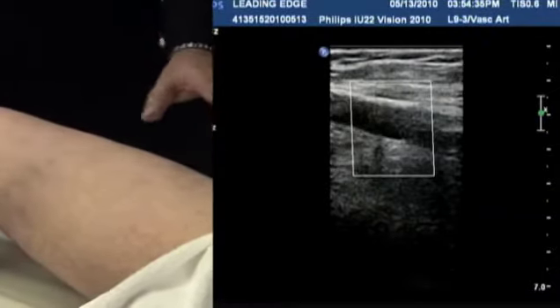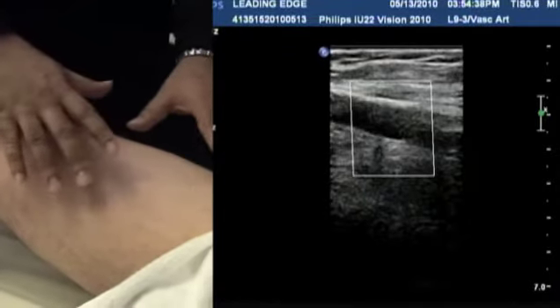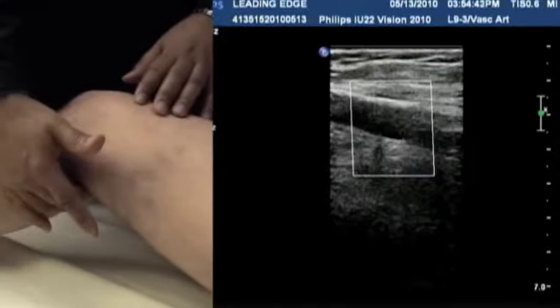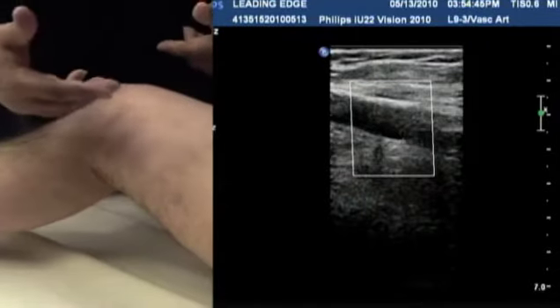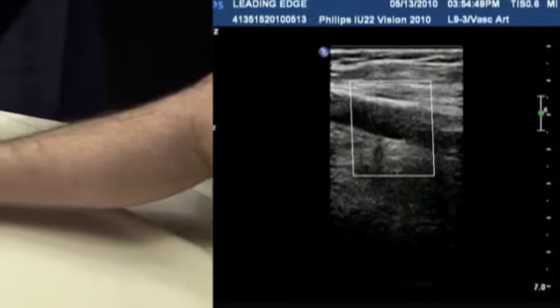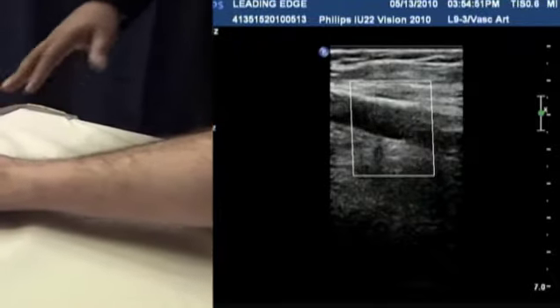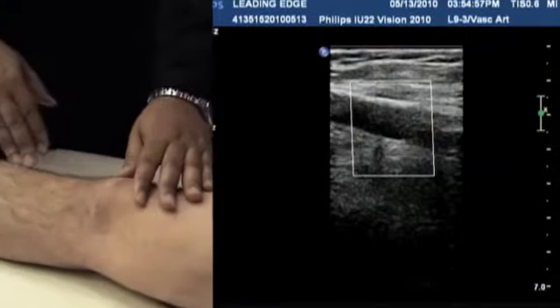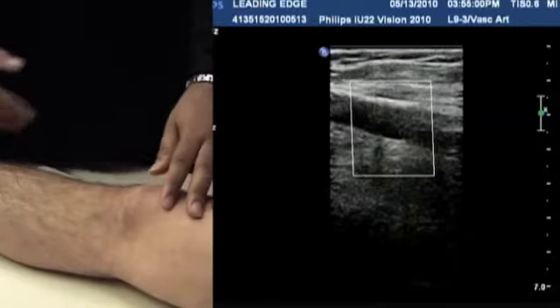With the patient in this position, we actually have access to all of the arteries of interest on the medial side of the leg, the common femoral, the superficial femoral and above knee popliteal, the popliteal artery behind the knee, although if I needed to, I could always turn him on his back or turn him more sideways, the origins of the tibial arteries and the arteries in the foot. To evaluate the anterior tibial artery, what I would do then is just straighten his leg out, and I can evaluate the origins of the anterior tibial artery on the lateral side of the leg.